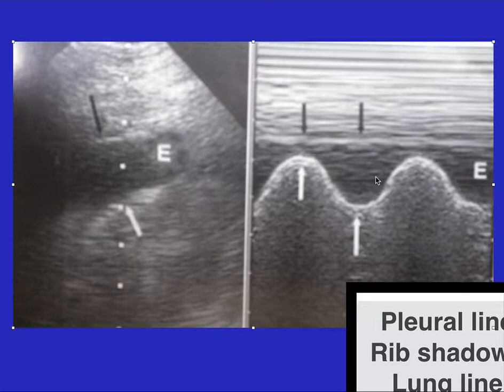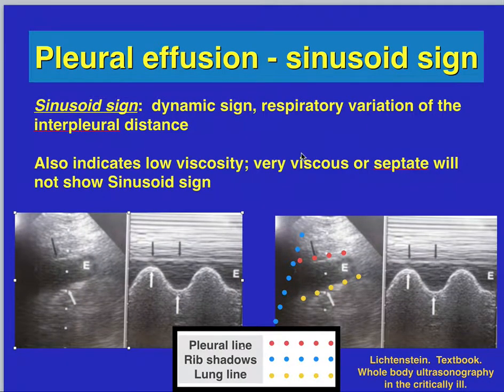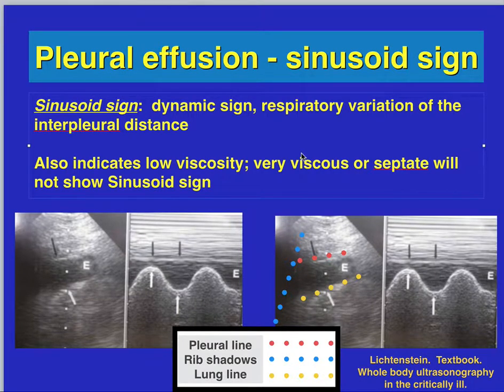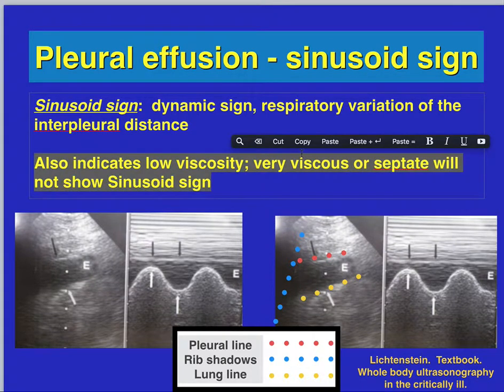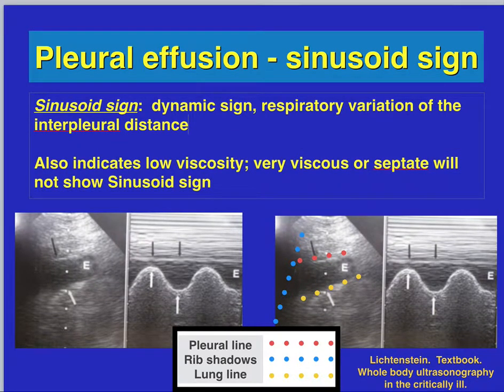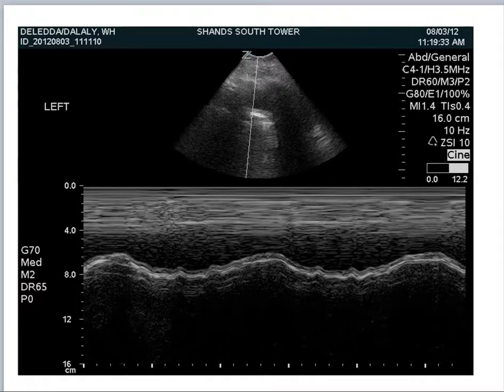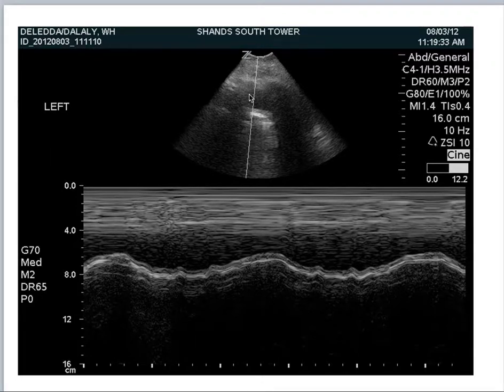The sinusoid sign is a dynamic sign showing respiratory variation in interpleural distance. It also indicates low viscosity fluid — very viscous or septate fluid does not show a sinusoid sign. In the image produced here, you see the pleural effusion, the rib shadows, and an M-mode through the pleural fluid and the lung. As the patient breathes, you can see a sine wave being formed.